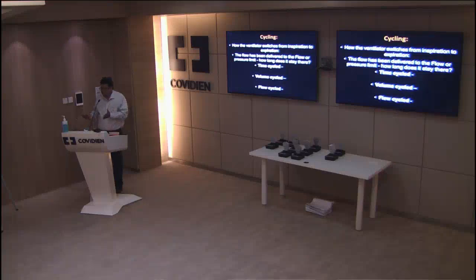But some other ventilator modes also have time cycling. That means after a certain time, automatically the ventilator knows it has to deliver a breath. Otherwise, you could have what is called volume cycled or flow cycled. We'll talk about that. So how does it cycle to expiration? It could be one of these three. Volume cycled means once a certain volume is reached, suppose you kept a volume of 500 or 450 or whatever volume you have set, then it cycles to expiration. And sometimes you have what is called flow cycling.